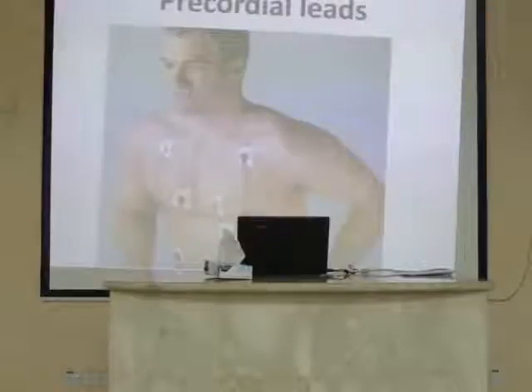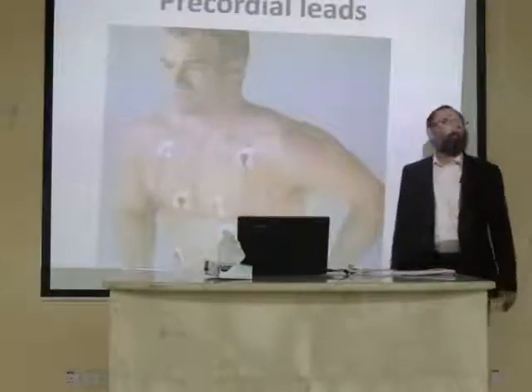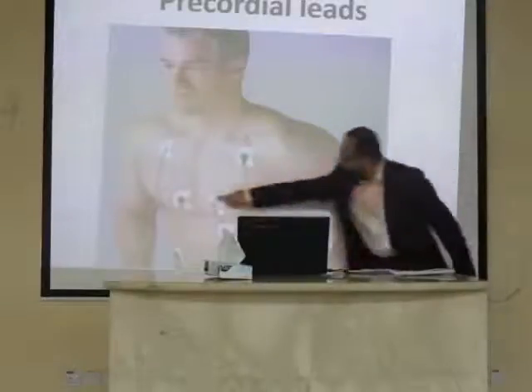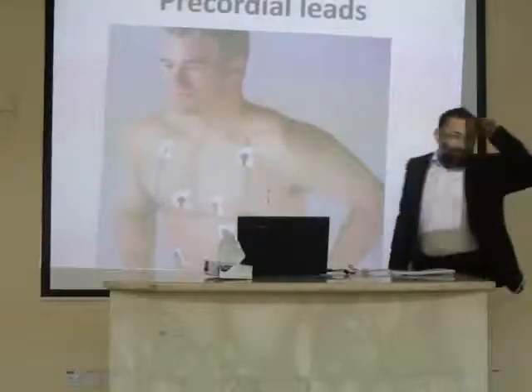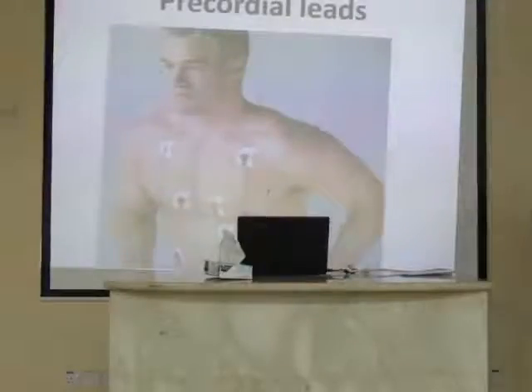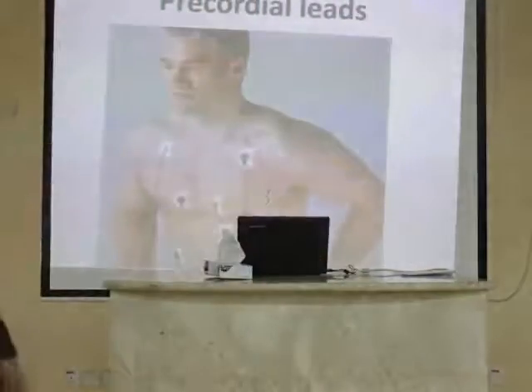10. Complete attachment. What do you think about these attachments 1, 2, 3, 4, 5, 6? Precordial, because they are on the chest, very close to the heart. This system is a precordial system. 6 electrodes are precordial electrodes. All right. The confusion is, what are these electrodes? The limbs.